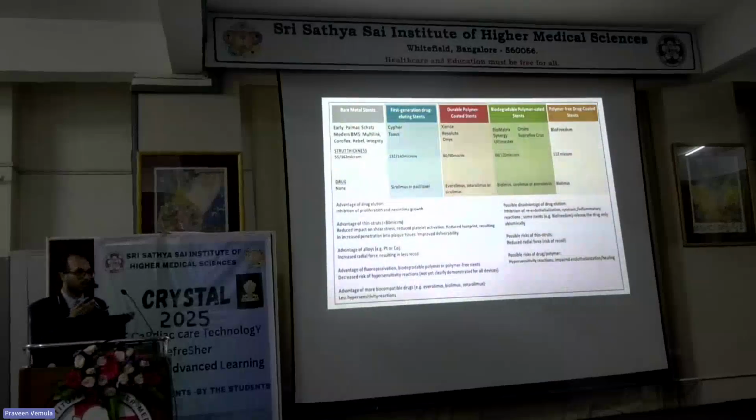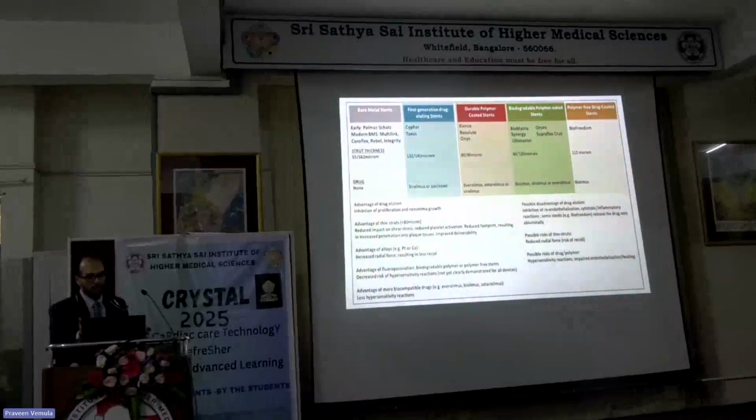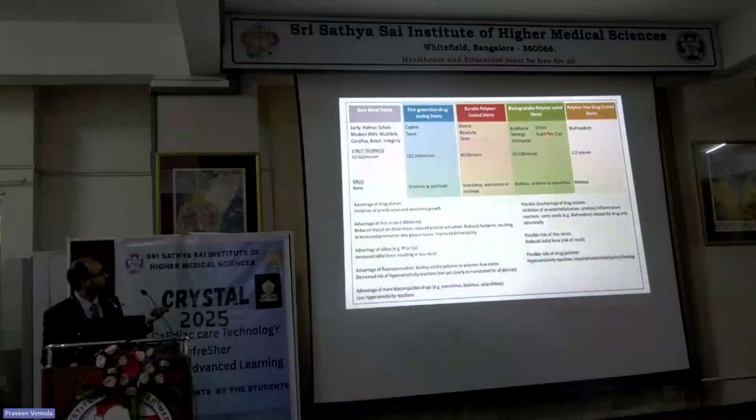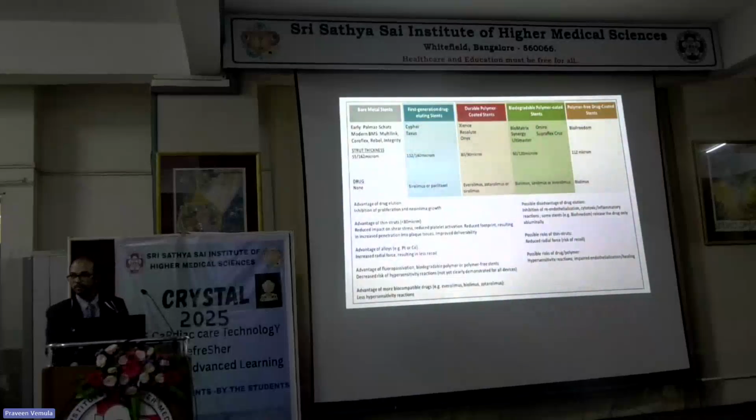So basically the polymer sometimes can cause some inflammation and cause restenosis, and so some companies have come up with the biodegradable stent wherein the polymer itself dissolves, like the Orsiro and the Synergy stents. The biopolymer coating goes over time. Put as simply as this, a primer is what is used on paint. That primer is the polymer, and that remains, even if the stent is there. If you had something which dissolves, called biodegradable, it wouldn't remain.